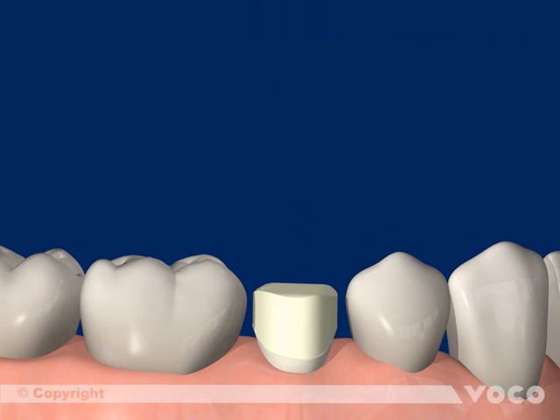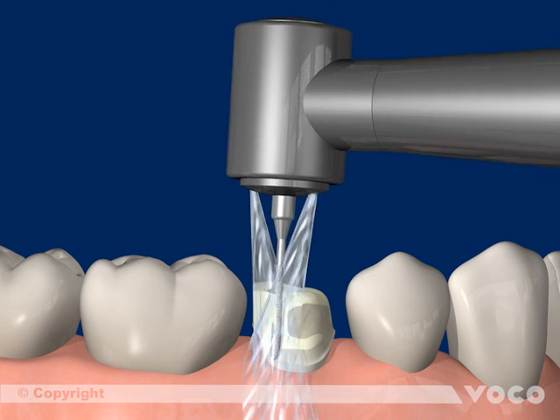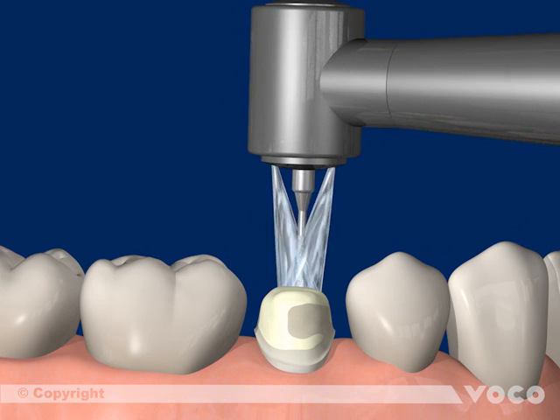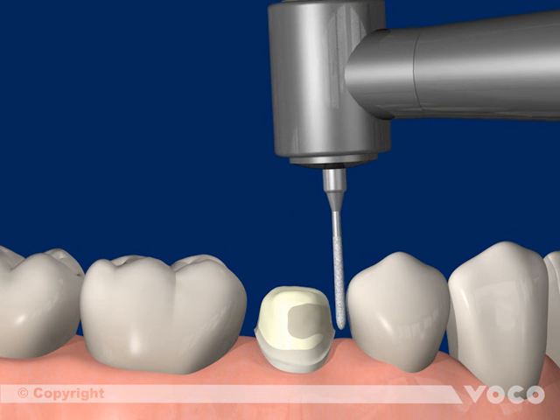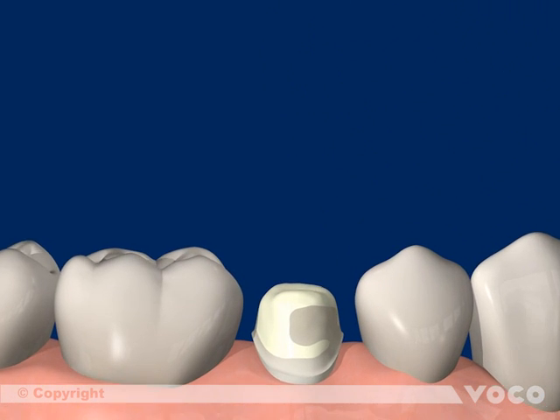After the material is completely cured and the matrix is removed, the core can be prepared.